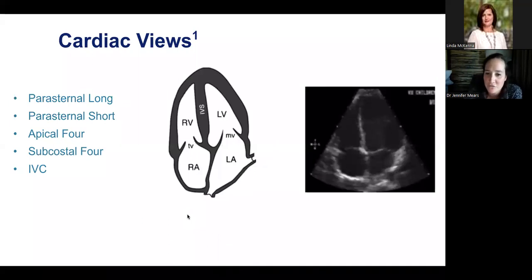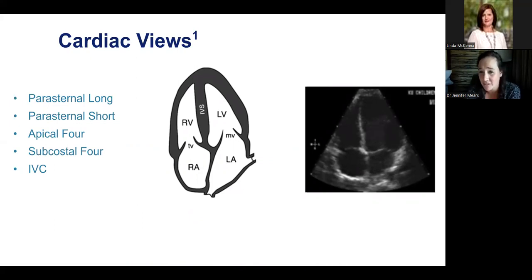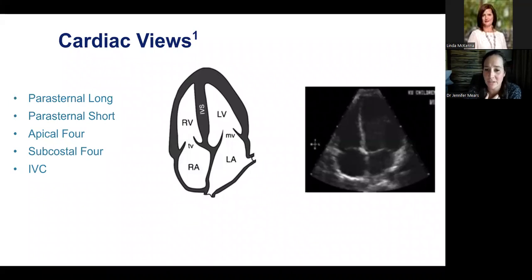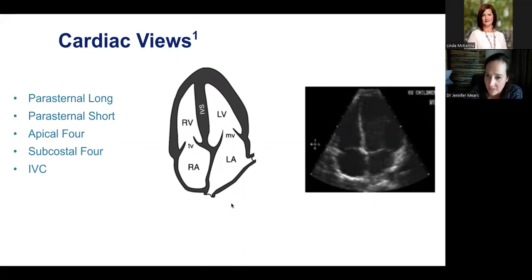The apical four view is a four-chamber view from what most people refer to as the mid-axillary line on the left. For critical care patients who cannot cooperate or get into a left lateral decubitus position, you may need to go more mid-clavicular. The apical four view gives a four-chamber view of left ventricle, right ventricle, left atria, right atria, and you can see both the mitral and tricuspid valves. This is also utilized in ejection fraction calculations on a machine-based status.